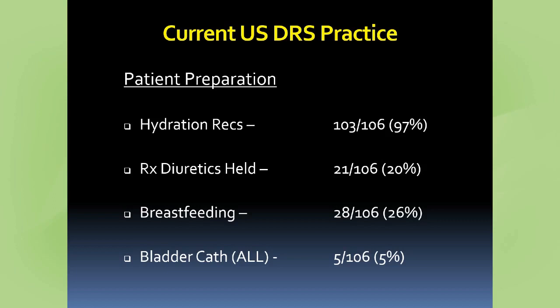And we're fortunate here in the inpatient setting, we actually can have them. We're hospital-based, so they can go by the urology clinic in the hospital, have that Foley catheter placed, and come down to us and do the study. Again, we let them know that that was at the request of their urologist.